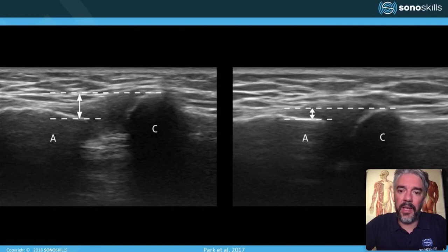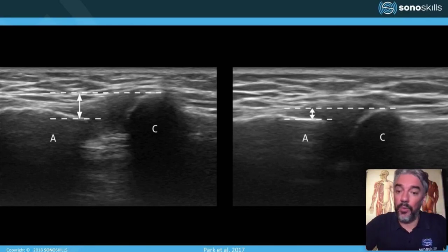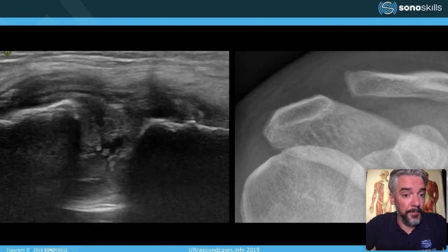And this is a pathology of an unstable joint doing the cross-arm maneuver, right? Within this maneuver, you can see that the joint space is getting more narrow, but also that the distance between the top of the acromion and the top of the clavicula is getting smaller. So there is a shift of the clavicula in this movement.